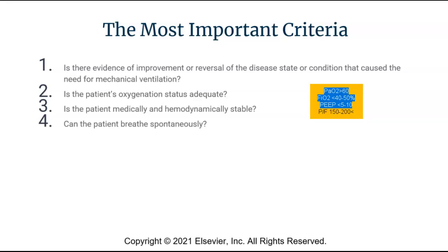And then finally, can the patient spontaneously breathe? They have to be able to breathe spontaneously in order to come off the ventilator. So if you have no spontaneous effort, you're not going to be attempting a weaning trial.